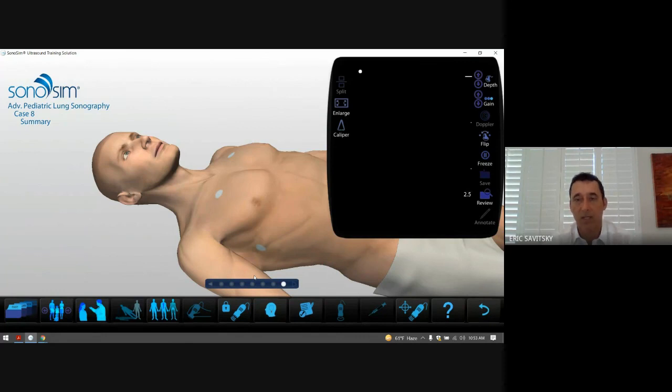an empyema. So just some examples of applying imaging in multiple different planes, transverse oblique, as well as parasagittal, and then using a lot of the artifacts that we talked about, whether they're B lines or coalescent B lines or a white lung appearance, as well as lung sliding and different modalities to identify lung sliding such as M mode, and then looking at pleural effusions and putting all of those findings into clinical context and helping to narrow the differential diagnosis and hopefully arrive at the correct diagnosis and optimize patient management.